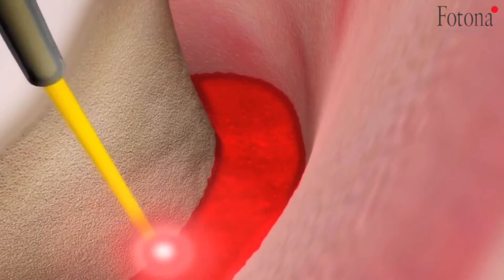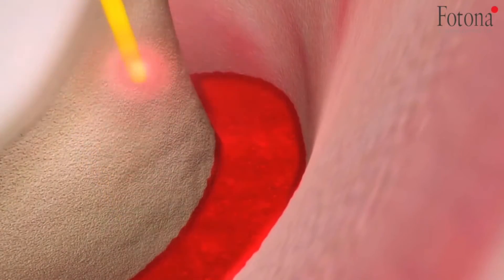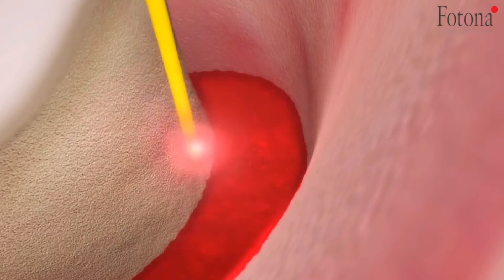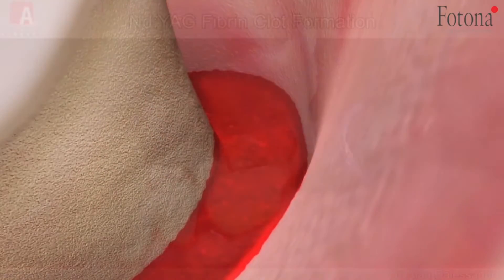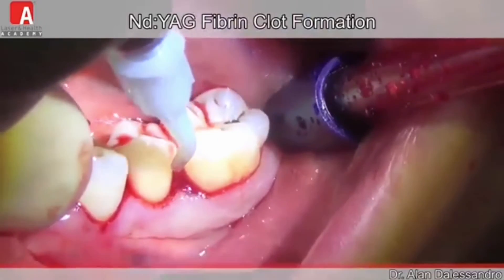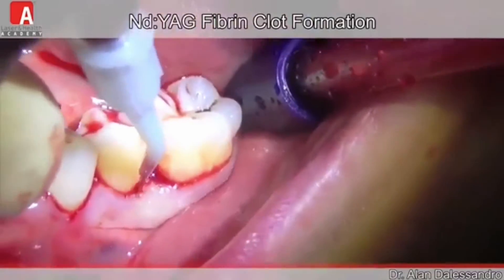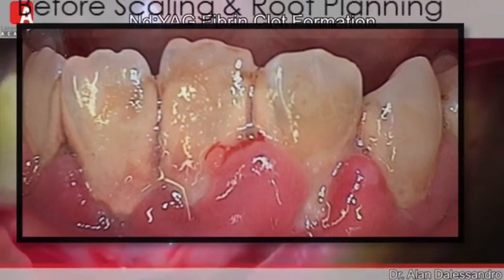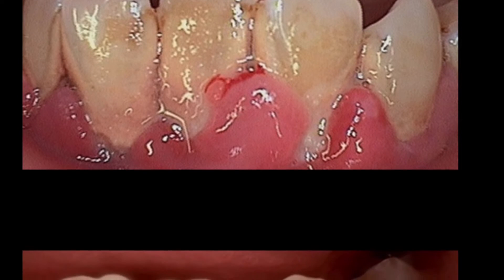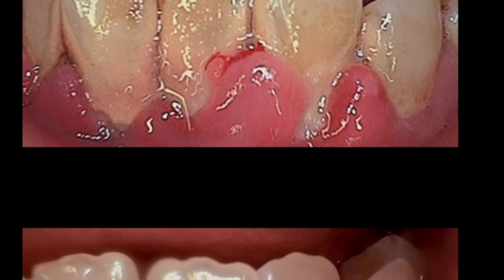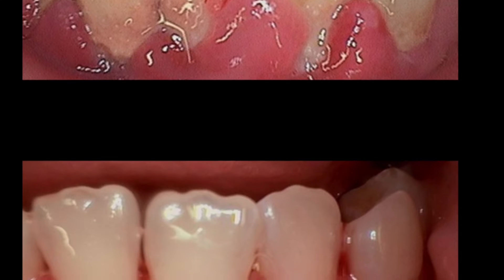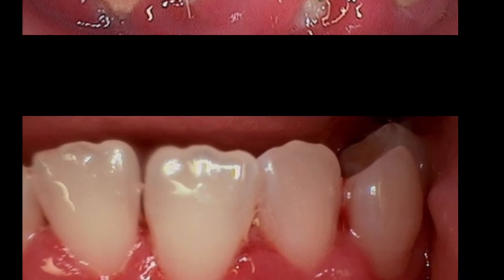Since the diseased tissue and all of the plaque and calculus were removed and we have a healthy pocket, the gums can reattach to the tooth, and this is accelerated by the formation of a fibrin clot, as you can see here by the laser. Here you can see an example of tissue that was inflamed around teeth before and after the periodontal treatment was performed. Look how healthy the tissue looks.